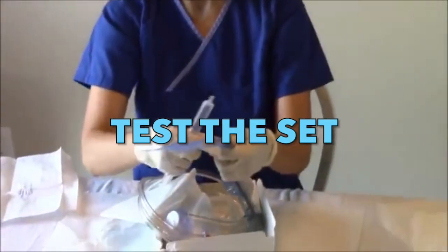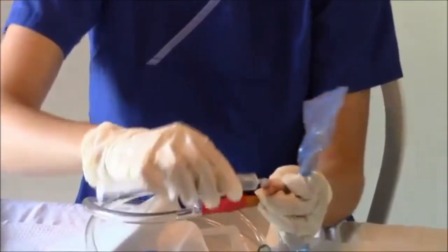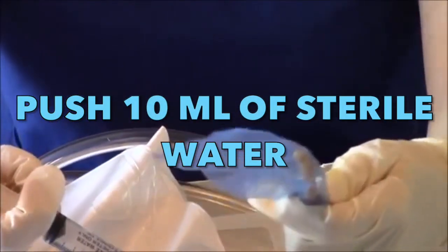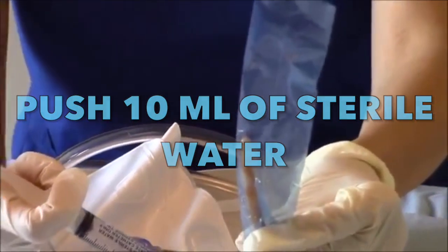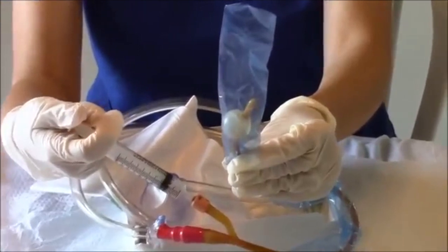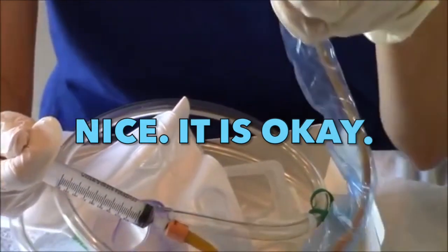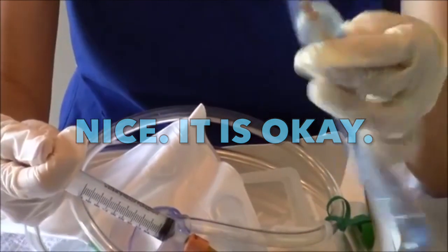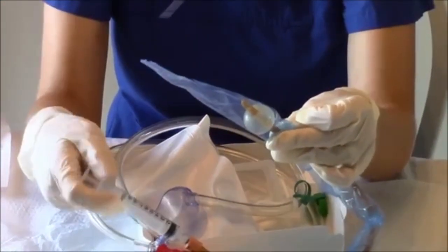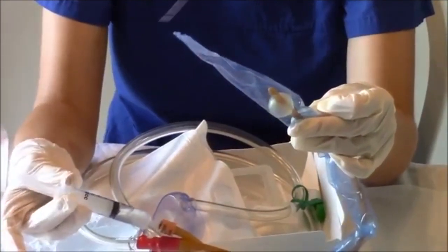Before inserting the foley catheter, we need to check if the balloon in the catheter is working. We are going to push 10cc of sterile water to check if it is patent and if the balloon inflates properly. You can see the balloon is working — it is fine and we can use it. Of course, do not forget to remove the sterile water afterward, because we will need to use this foley catheter for the actual insertion.